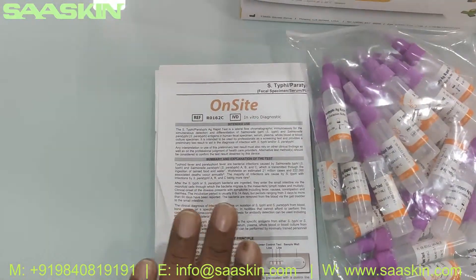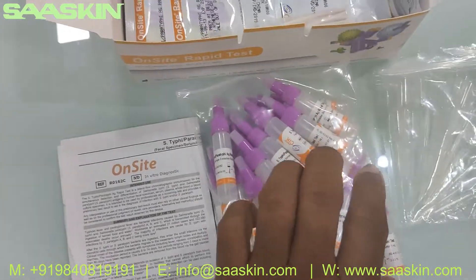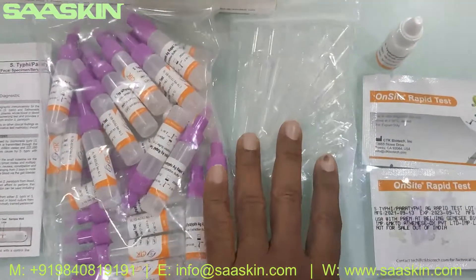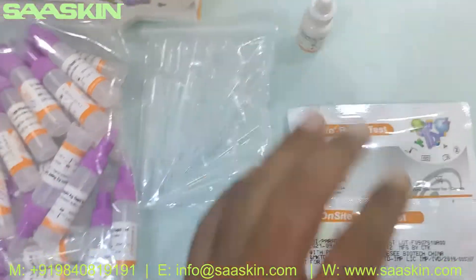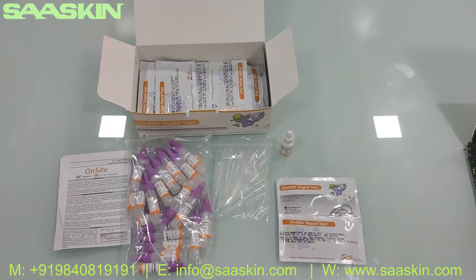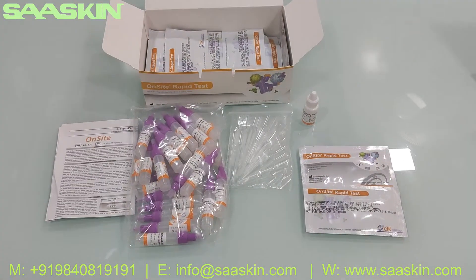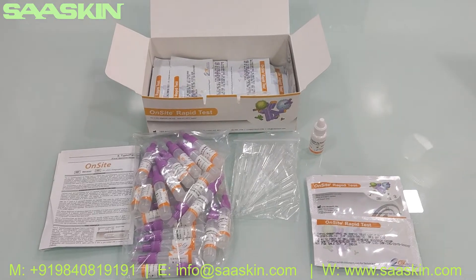So quickly, you get the IFU brochure, 25 specimen collection bottles, 25 plastic droppers, one diluent buffer, and 25 test cassettes. This is how the total test kit looks like. Thank you.